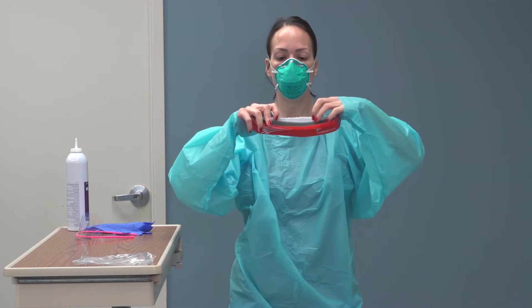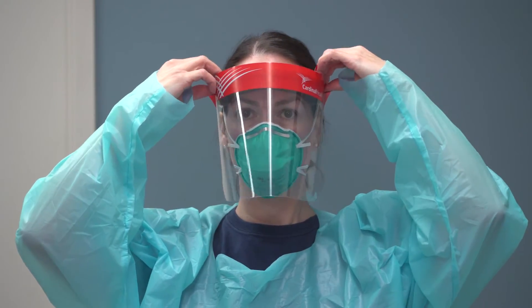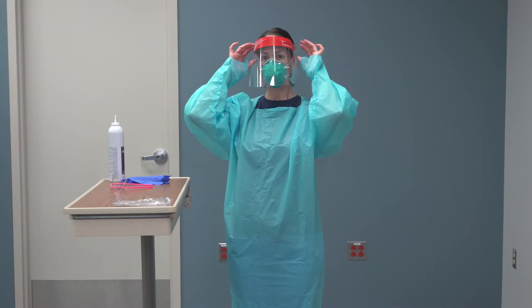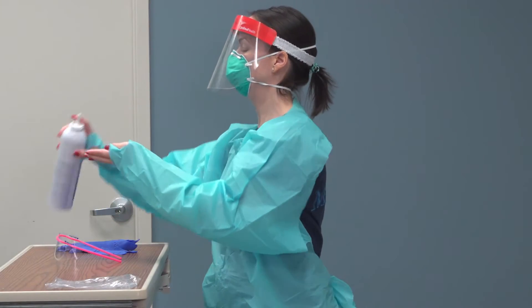Apply goggles or eye protection. Ensure forehead strap is one inch above eyebrows. Healthcare provider has the option of eye protection — they may choose between a complete face shield or eye shield. Perform hand hygiene.